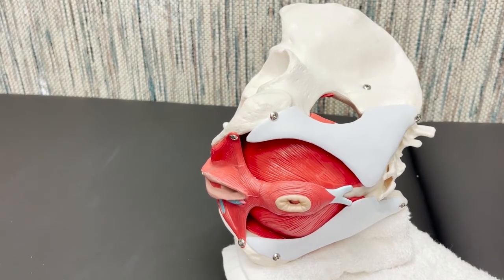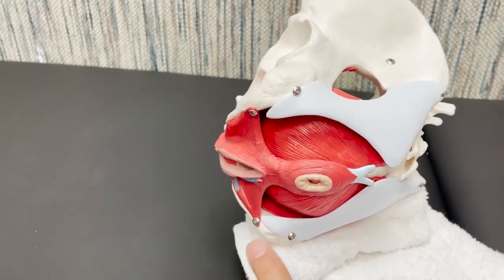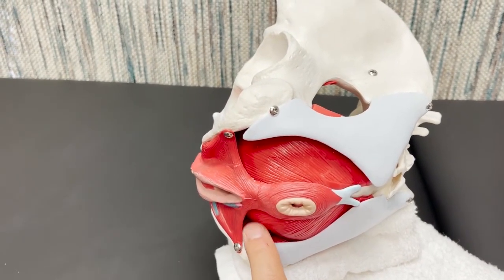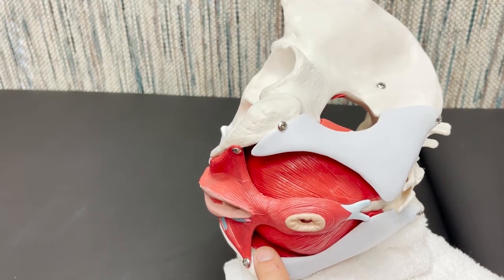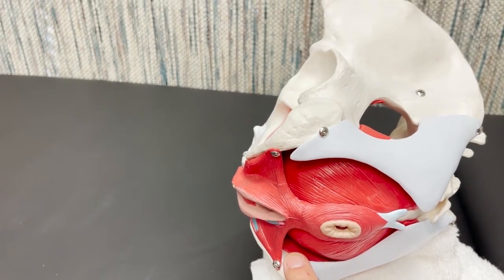In our side lying position, again, the treatment leg is mat side, top side leg is flexed at the hip and out of the way. We're going to palpate again the medial side of the ischial tuberosity adjacent to the perineal body, just as our location here. We're going to needle down to the medial aspect of the ischial tuberosity, and then we'll redirect the needle 45 degrees cranially to land in the obturator internus muscle.